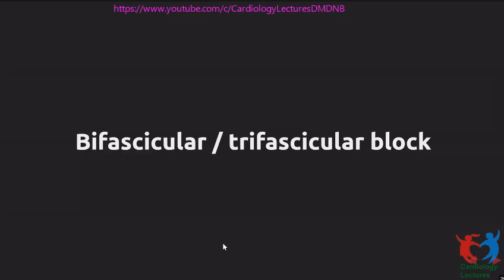And when we put a temporary dual chamber pacemaker in this patient, and we paced her, we found that with pacing the atrium and ventricle with the physiologic AV delay, we were able to abolish this pulsus alternans. So then we went ahead and implanted a permanent pacemaker, and with that, the patient's heart failure resolved and the patient improved.